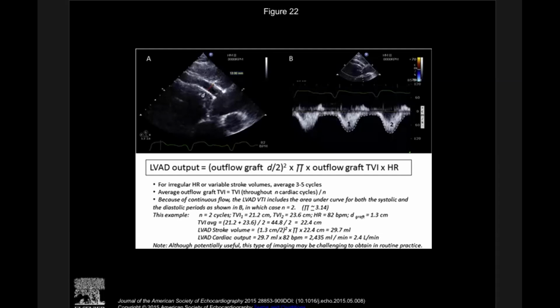Yes, many of these patients have LVADs. So absolutely, because remember, the AICD is typically on the right side, or it can be within the coronary sinus. The inflow cannula is going into the apex. And even if you have an RVAD, those are anastomosed distally. So a lot of these patients have AICDs and the LVAD, they're still at risk for having arrhythmia. So yes, patients with CRT can still get LVADs.